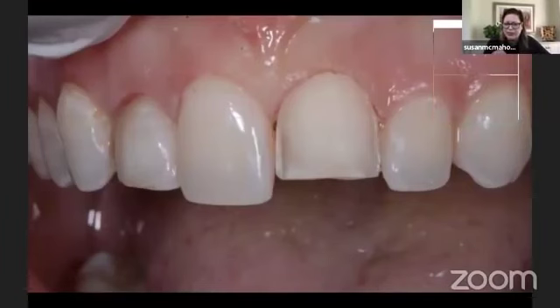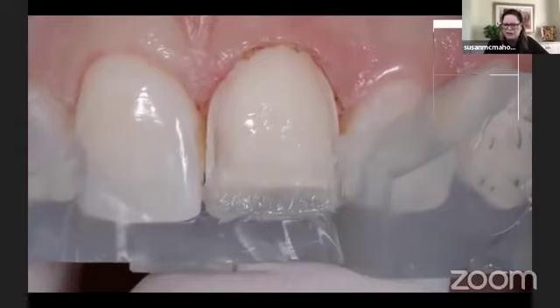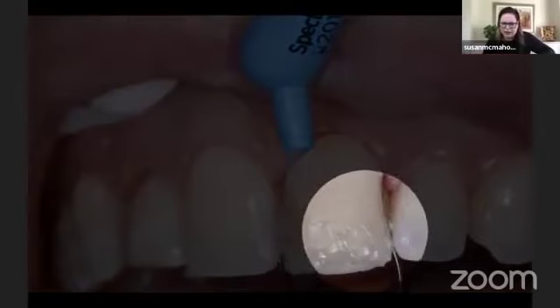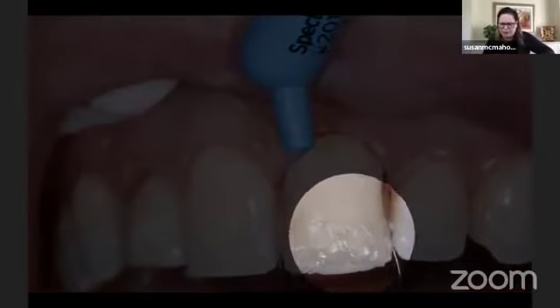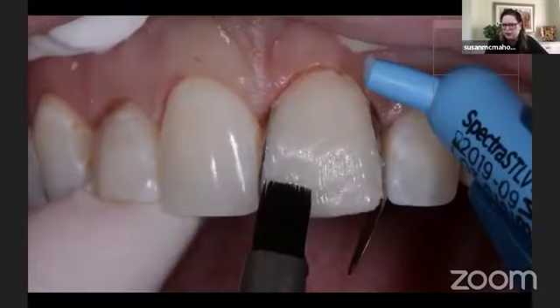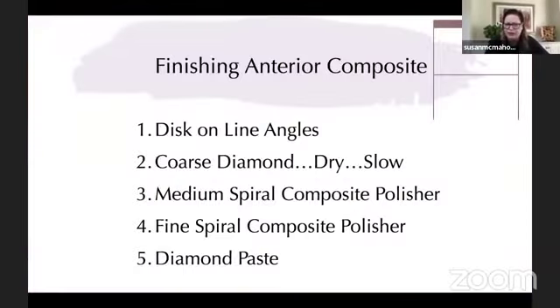So I'm going to take that first case and just put the composite on it quickly, and we're going to get right to finishing. So here it is without the composite on it. I've used a little stent. I'm going to just use two shades of composite to do this. I'm going to use a translucent white, so a white enamel on the lingual. I'm going to build out the incisal edge. Then I'm going to use a body shade, an A2, to get the rest of the body on there. And you see I'm making the lobes of the dentin with this A2. And then on top of that, a little bit more of the white enamel, another translucent shade. And then we're gonna get to the good part.